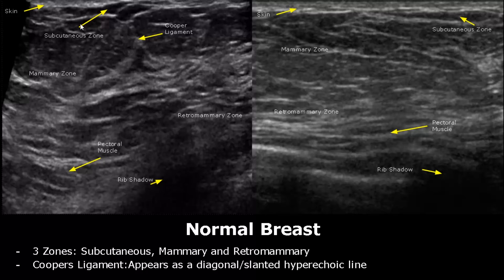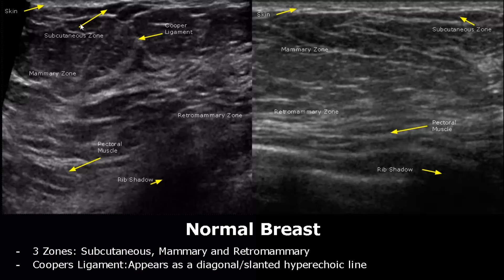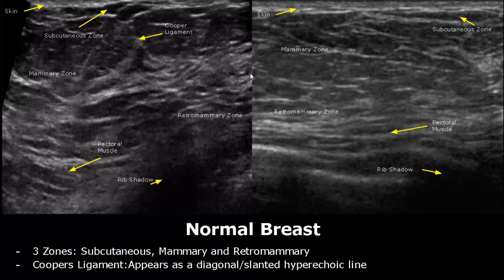Here we have images of normal breast. The uppermost layer is the skin, which is the hyperechoic layer. Below that is the subcutaneous zone, which is usually hypoechoic compared to the tissues below. The largest region is the mammary zone, which usually has mixed echogenicity. Most pathologies occur in this zone. The hyperechoic area is the fibroglandular tissue, and these hyperechoic slanted or diagonal lines are Cooper ligaments. This striated structure is the pectoral muscle.